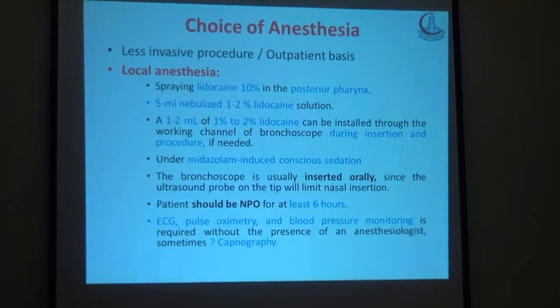الشويس أوف انستيزيا، البروسيدر لاس انفيزيف وبيتعمل على أوت بيشنت بيزز. أغلبية السناتر الصراحة بتشتغل لوكال انستيزيا. أنا بحب أفضله لما بشتغل نعمله جنرال انستيزيا، بيبقى مريح أكتر. طبعا لو بنشتغل باللوكال انستيزيا بنعمل سبراي لايدوكين في البوستيرير فارنكس، اللايدوكين اللي ليه حتة طويلة، بنحطه كده في البوستيرير فارنكس، وممكن قبل ما نبتدي البروسيدر نعمل نيبلايزيشن 1-2% لايدوكين، والبيشنت بعد كده، واحنا شغالين بنسبراي على الوركينج شانل بتاع المنظار، سبراي أز يو جو.